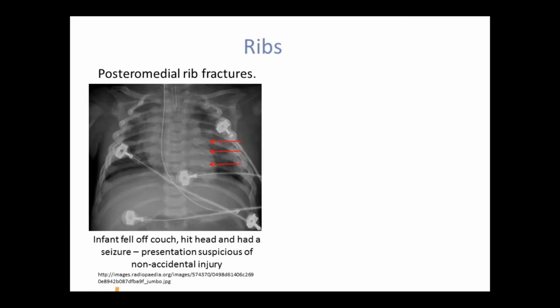Fractures of the scapula, spinous process, and sternum are also specific for non-accidental injuries but are less common. If these signs are seen on a chest film, look for other signs that are highly correlated with non-accidental injuries, including multiple fractures elsewhere in the body, fractures in different stages of healing, delay in seeking medical treatment, and other coexisting injuries. Note that hospital protocols may vary in regards to reporting non-accidental injuries. It is quintessential that any suspicions be reported to Child Protection Services or an equivalent agency at your healthcare center.